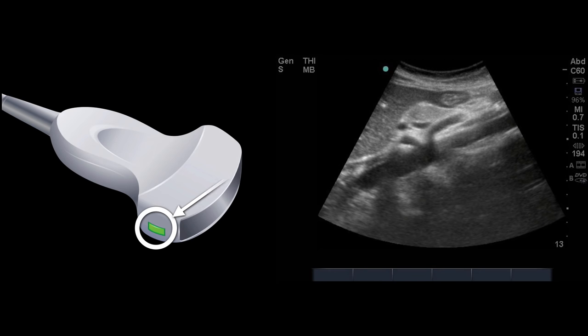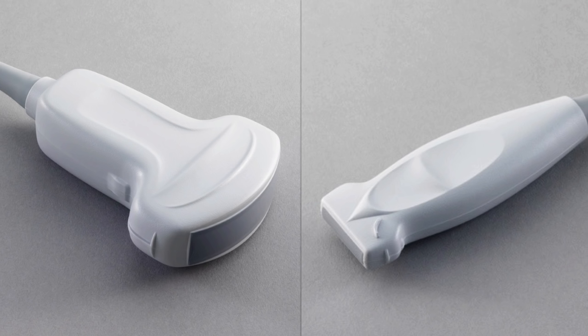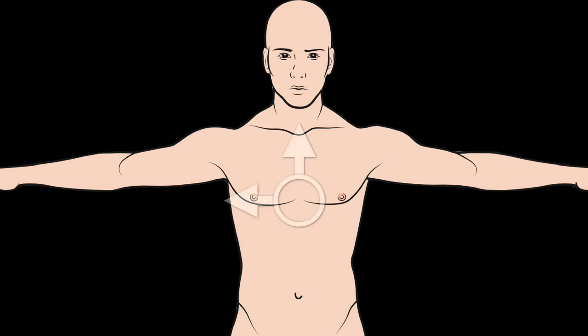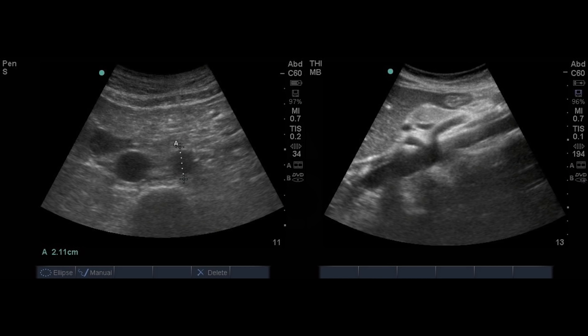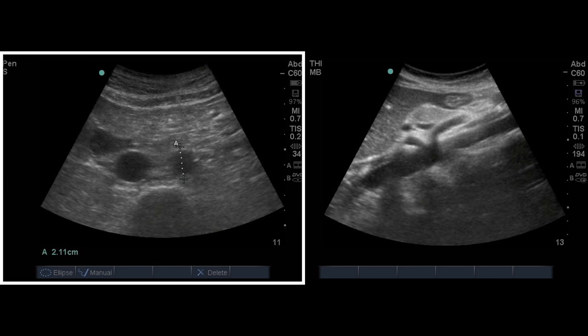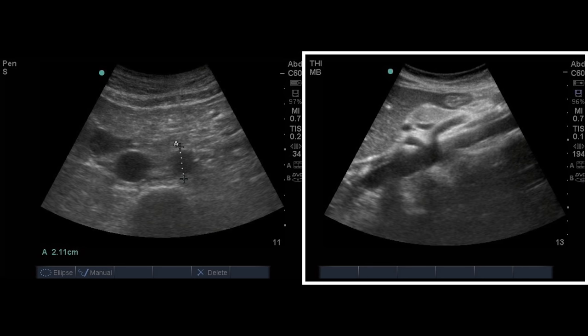Orientation: there is an indicator on the probe which aligns with the indicator on the screen, though indicators may vary by probe and manufacturer. By convention for abdominal preset orientation, the indicator is pointed towards the patient's right, the patient's head, or somewhere within that 90-degree plane. On a transverse image, the indicator pointed to the patient's right tells you which is right and which is left. On a sagittal image, with the indicator towards the patient's head, you can tell which direction is cranial and which is caudal.